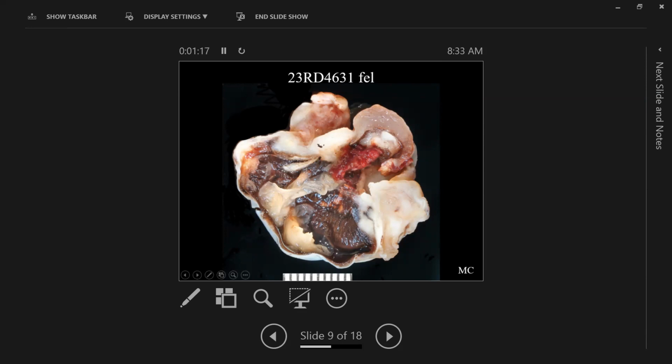This is a situation where we'd probably suspect that the lens is somewhere on the living room carpet or perhaps the driveway, i.e. it has probably been expelled through the corneal perforation site. And then we have some sort of translucent tissue back here, which is probably detached and torn retina.